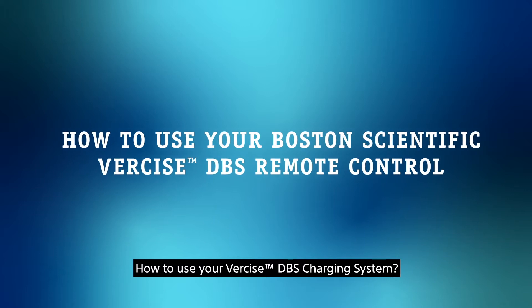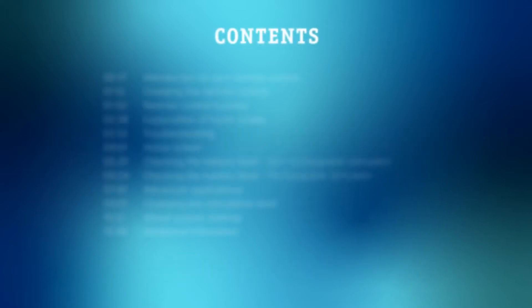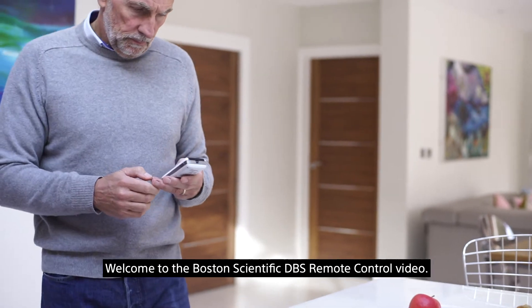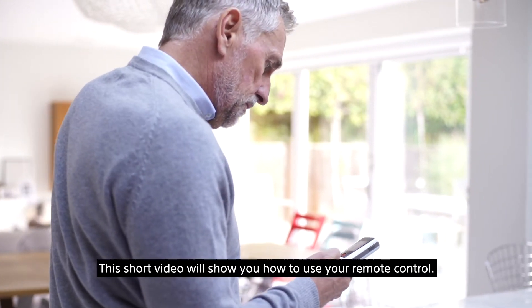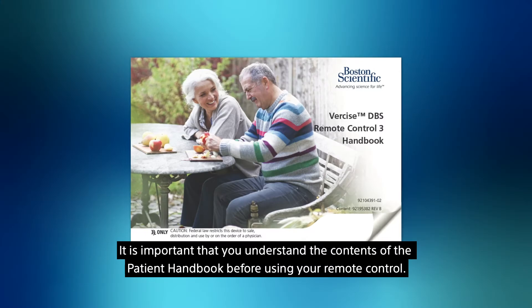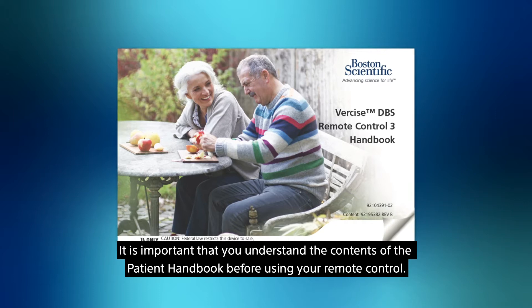Welcome to the Boston Scientific DBS Remote Control video. This short video will show you how to use your remote control. This video is not intended as a substitute for your DBS patient handbook. It is important that you understand the contents of the patient handbook before using your remote control.